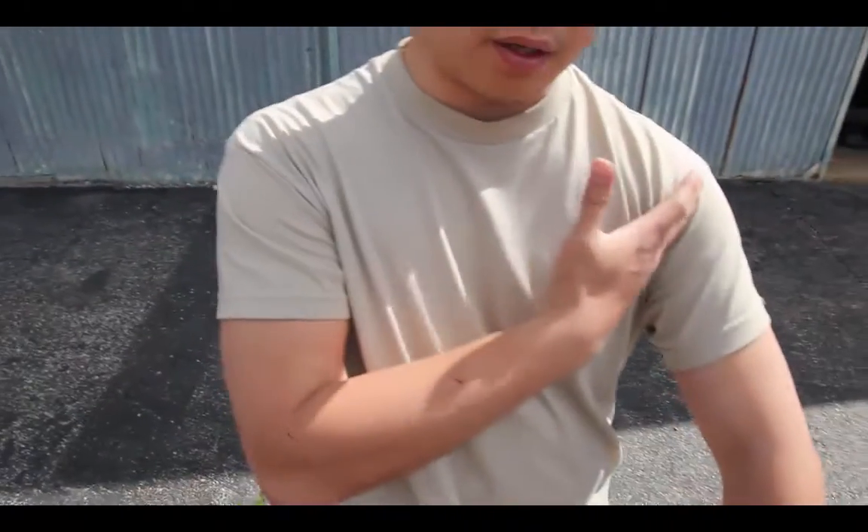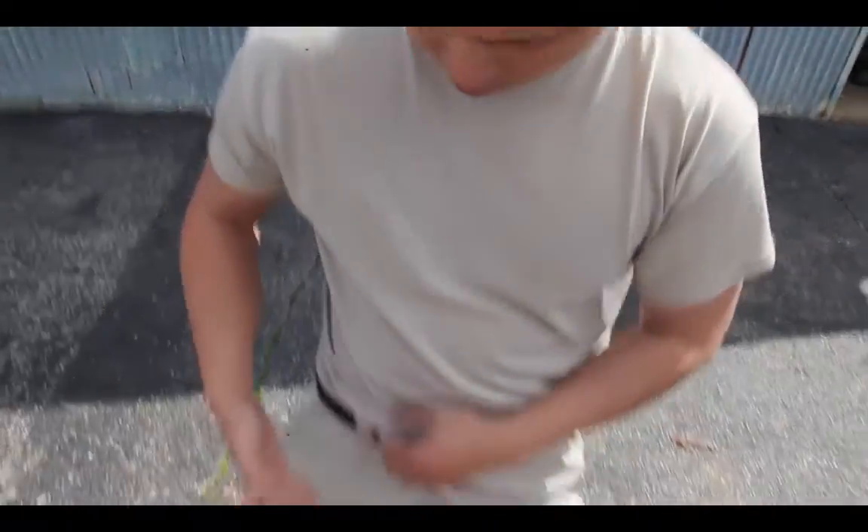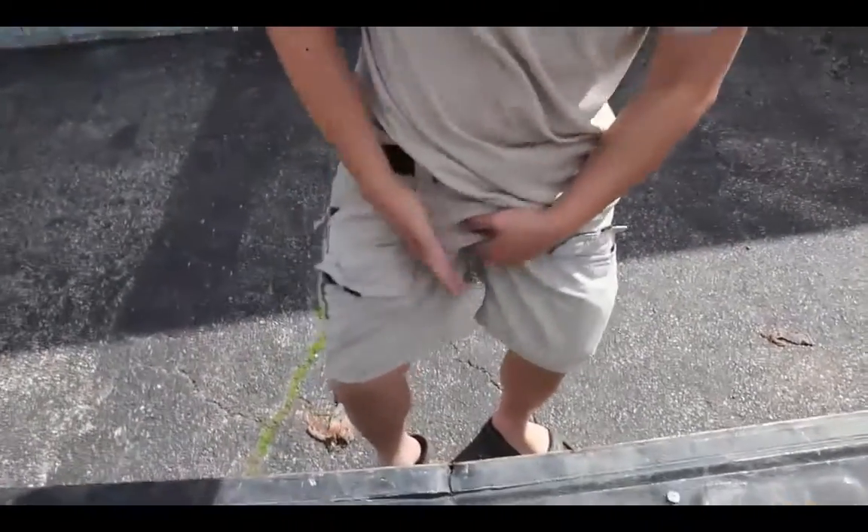Basics on tourniquet use: tourniquet application needs to be high and tight on the limb. High and tight on the limb — whether it's either arm, way up in here, or all the way up to your leg or your groin crease, way up in here.